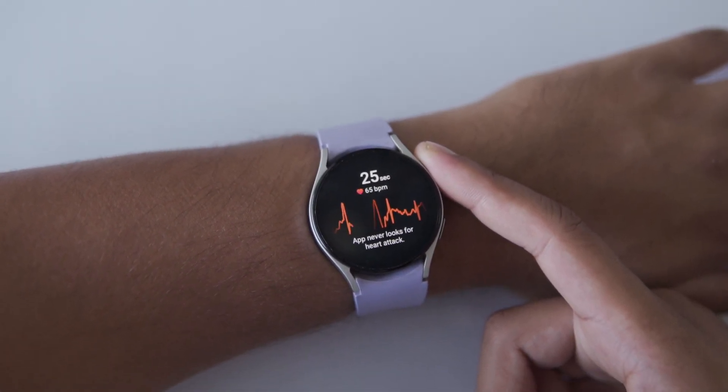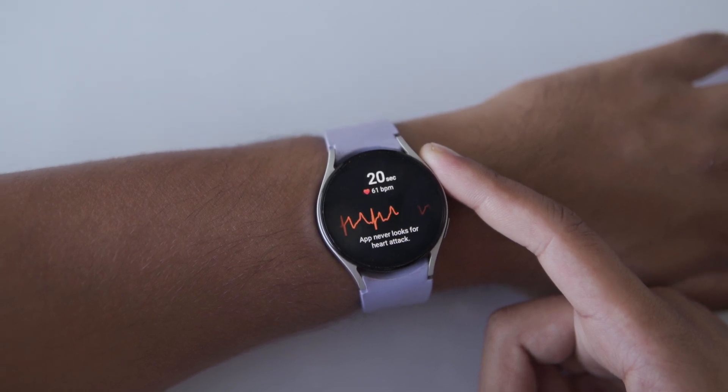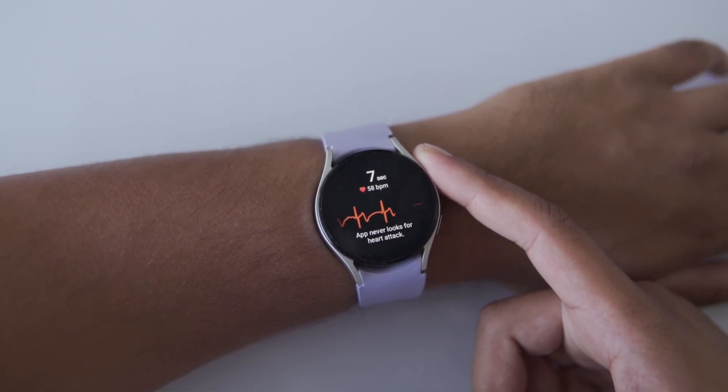Don't worry — a countdown will appear on your watch screen, so you'll know exactly when to stop. Just remember, don't press the button during this step. If you press it, the recording will stop. You need to keep your touch super light.